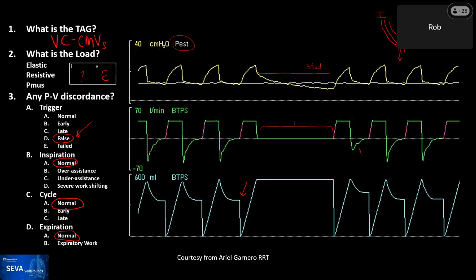Exactly. All righty. Eduardo, if I remember well, I think it was a case of a deflated or broken cuff. I don't know. I think that this one said a bronchopleural fistula. But you know the case better, Ariel. All righty. Very good.